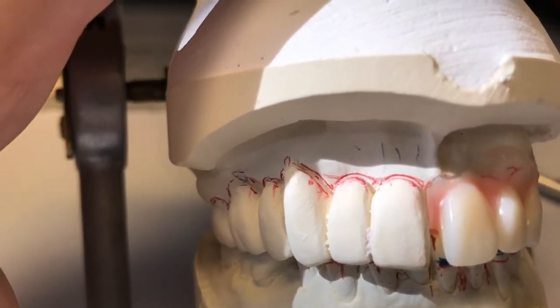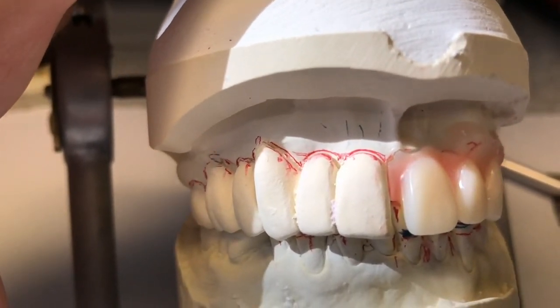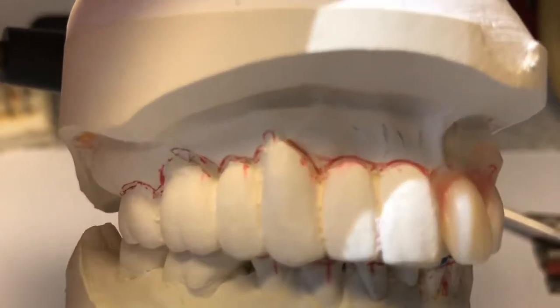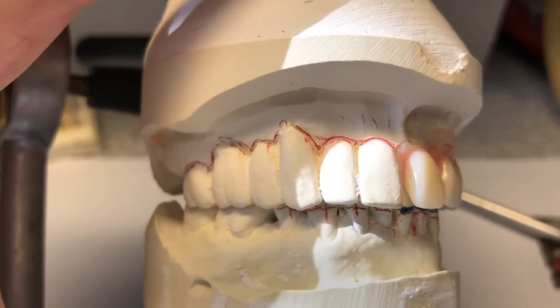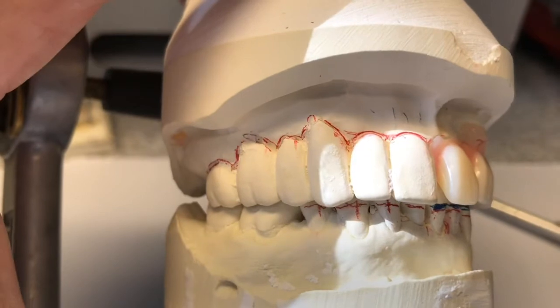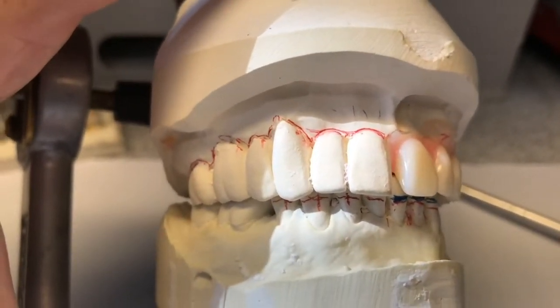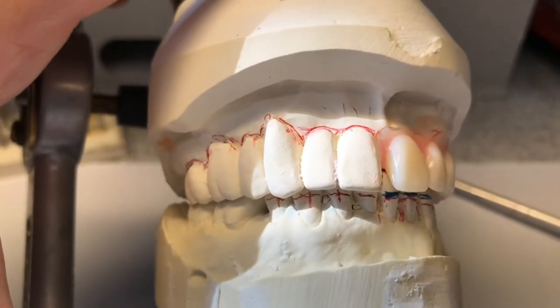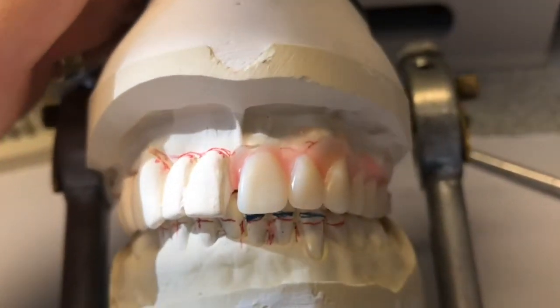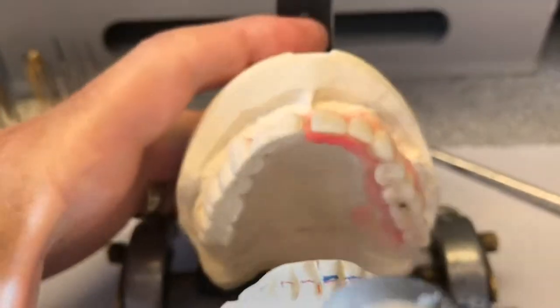I don't want to take away the bony areas because if I do and the oral surgeon does not, the denture is not going to seat. If I'm conservative, then the denture will always seat. The surgeons are not going to want to be getting out PIP paste and trying to figure out why the denture isn't going in right after all those extractions and sutures. So next I'll grind these teeth off, do some significant grinding on the denture teeth themselves, set those right on the cast, then festoon around it and process it.